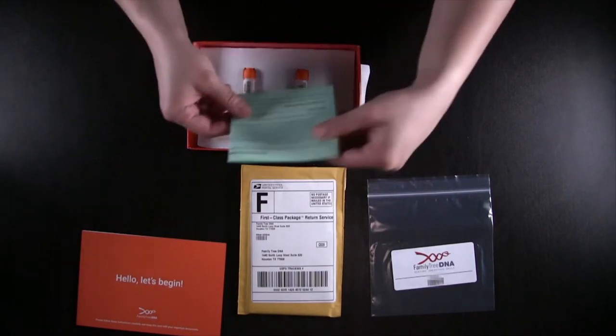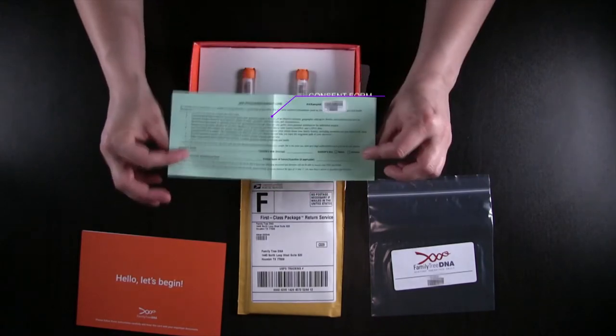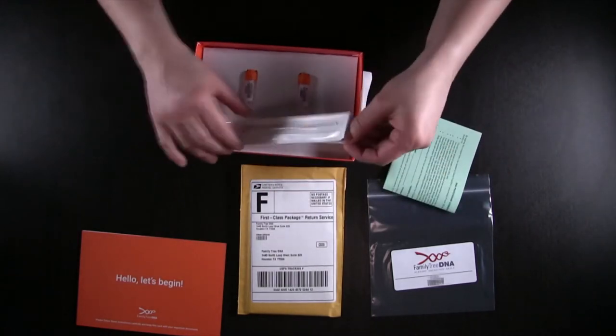I wasn't sure what this was, but this is actually a consent form. So you would put your name and you would sign it. This is to make sure that they can process your DNA. These are just the cheek swabs.